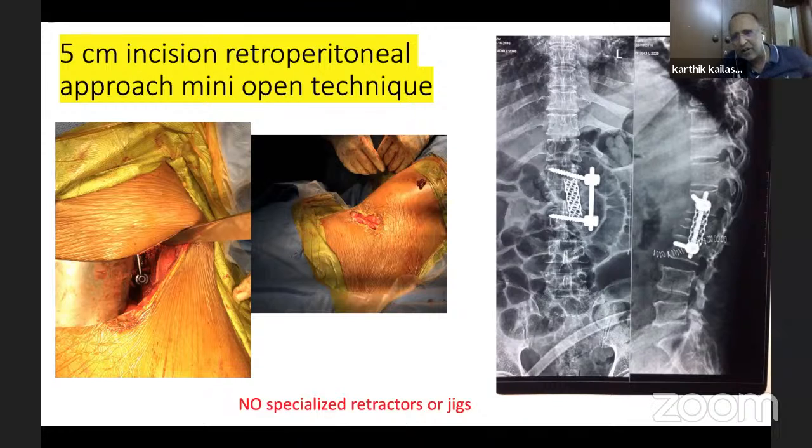My emphasis on this is that most of the times we are stuck with companies not having retractors, not giving retractors to people. And therefore, how do we modify it? My take on this was that we'll go ahead and show that this can be done with just 2 instruments or 2 retractors, which is easy to be done and quite comfortable to be done.